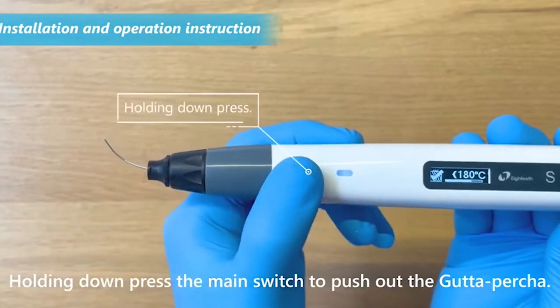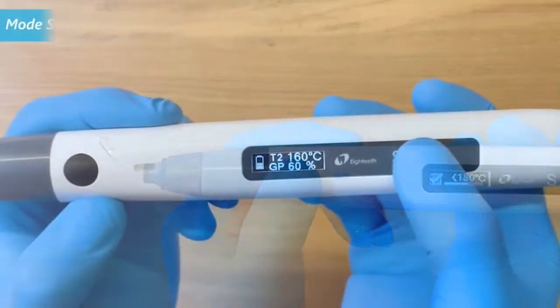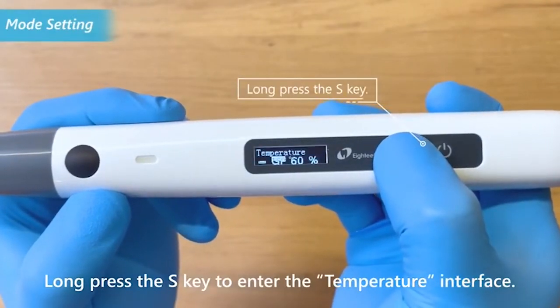Hold down the main switch to push out the gutta percha. Long press the S key to enter the temperature interface.